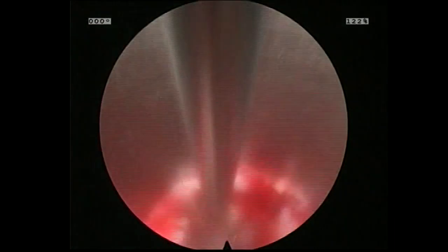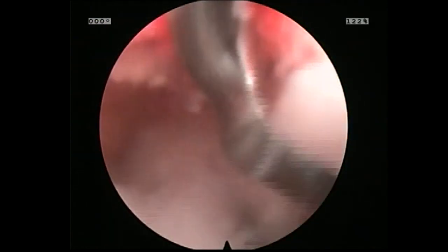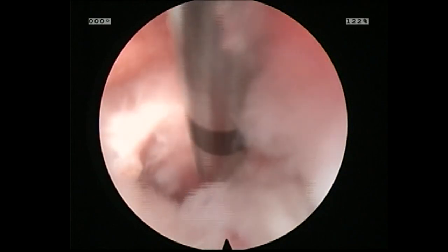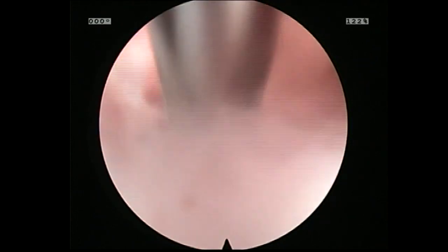Here we are inserting the endoscopic curette down the tubular retractor. This method allows you to have a much larger instrument than if you were just to insert it down the working channel alone, and this is one of the key design elements that we have with Flarehawk.